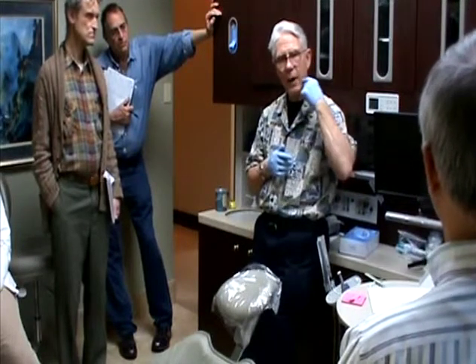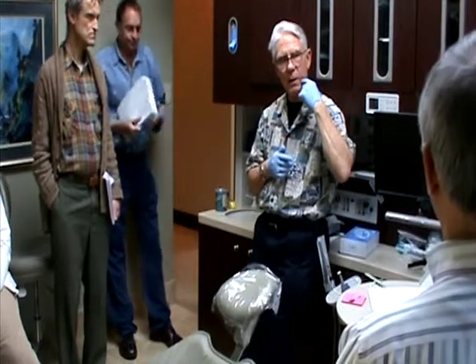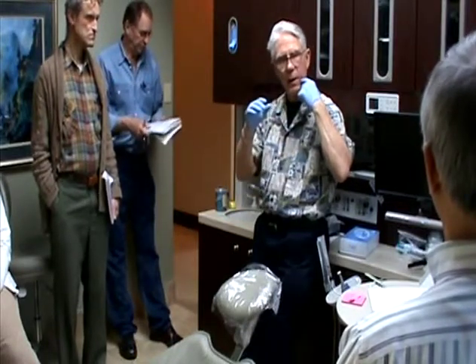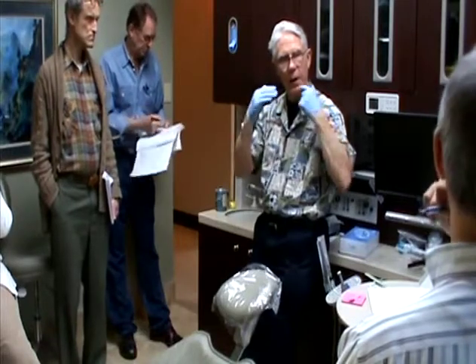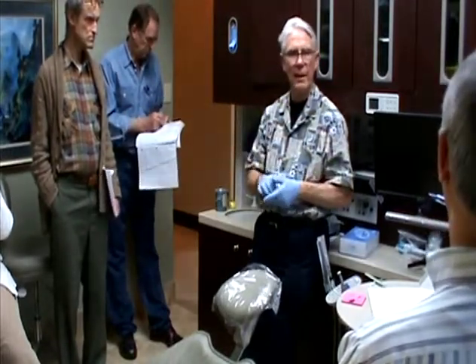And so 16 now you got. Add 10 more to the side you just did. Close the vertical down to that. Same way. Lock it down. Lock it down, open up the top, lay it in there and pull it down. Now you got 16 on this side. Right. Got it.